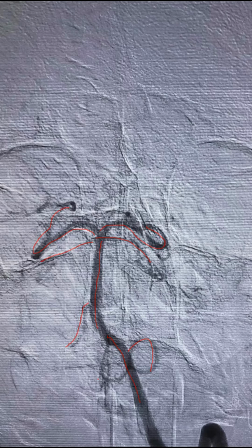PICA on this side. So as is always discussed, if the PICA here is big, the AICA is small. And the opposite vertebral is not seen because if you give a very forceful injection, there will be a reflux of contrast into the opposite vertebral. Here it is not seen.